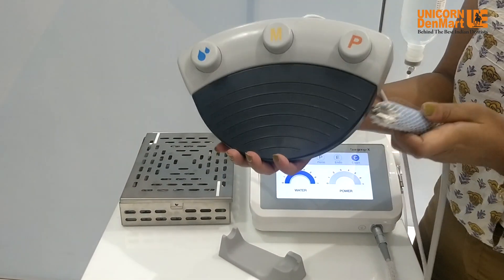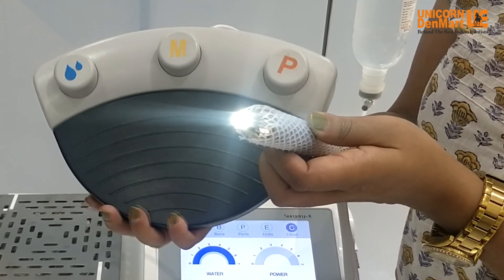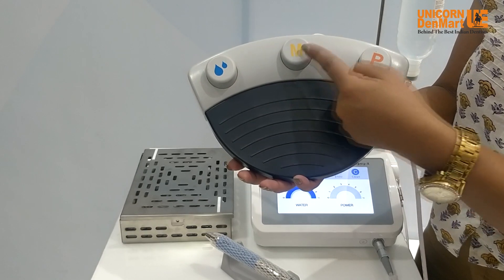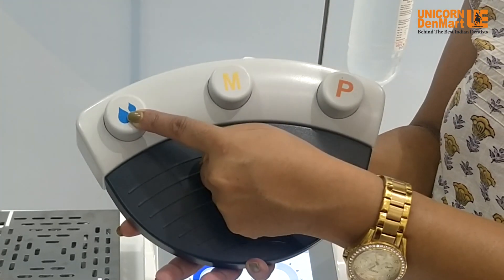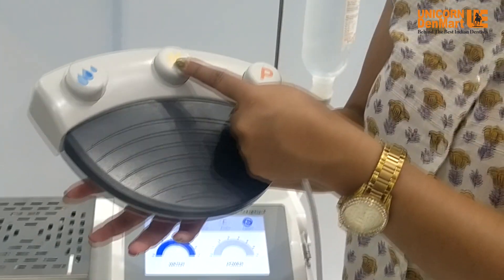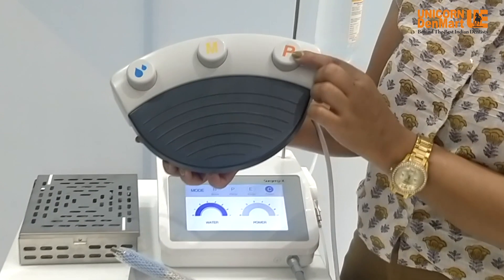The speed of the handpiece can be adjusted with the foot control without touching the screen. The first button allows adjustment of water flow for continuous operations. The second button is for selecting bone mode, perio mode, endo mode, or cleaning mode.